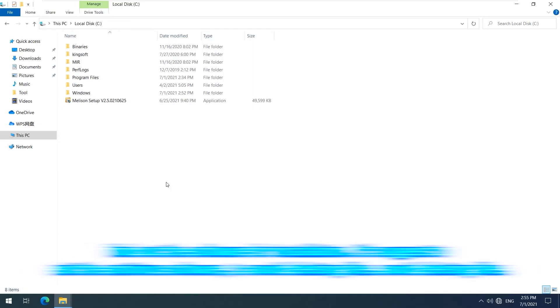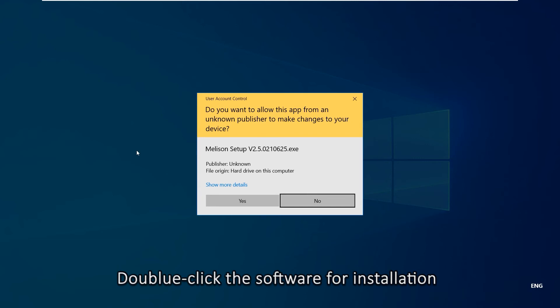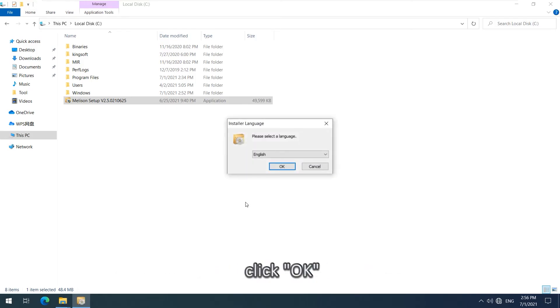Melison Equipment Management System software installation: find the software for installation. It is suggested to exit antivirus software to avoid deleting files. Double-click the software for installation and click OK.